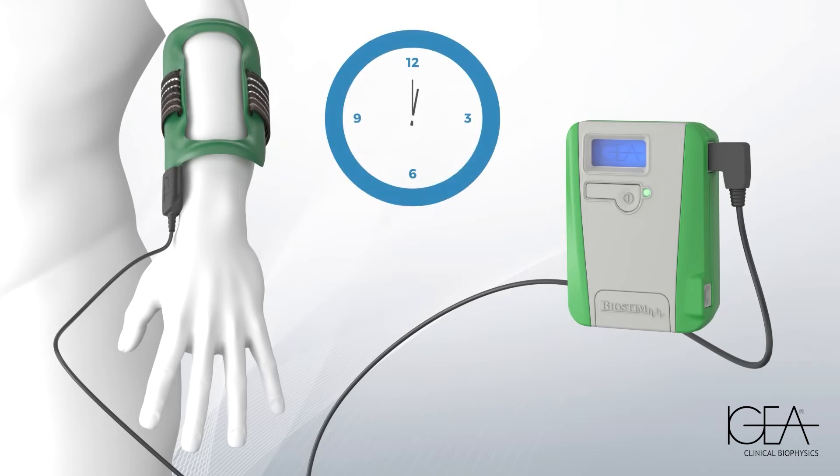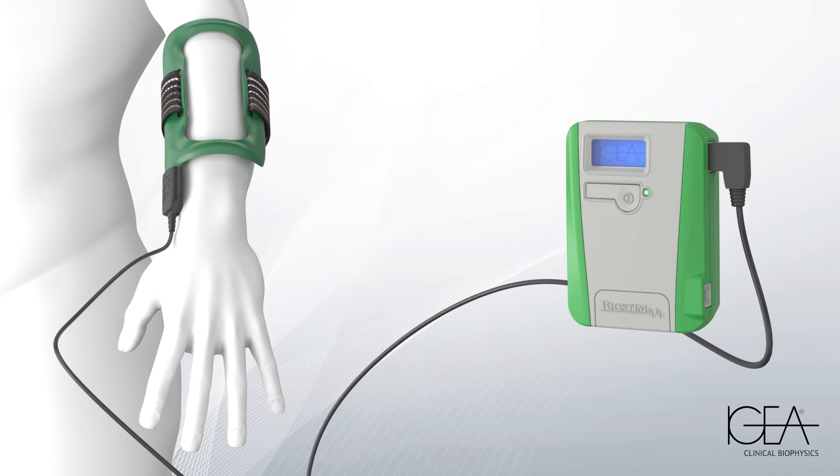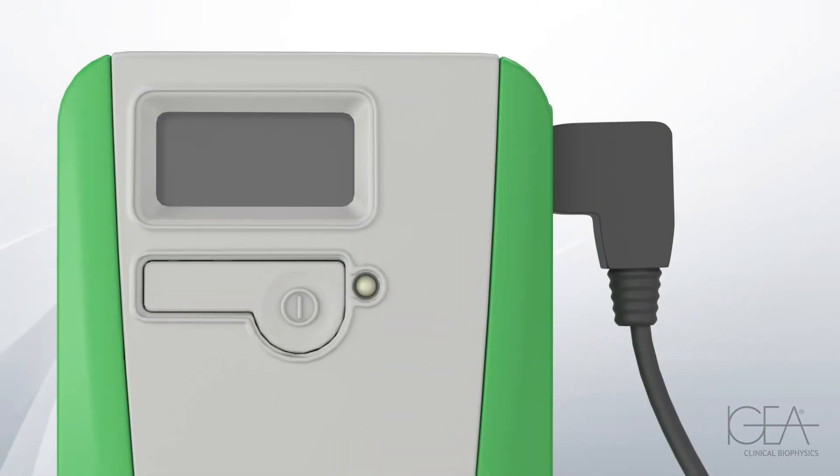After 8 hours of treatment, the device stops delivering the therapy and remains in standby. The treatment can be divided into 2 sessions of 4 hours each, and it can also be done overnight.